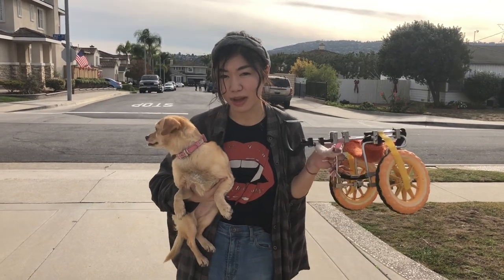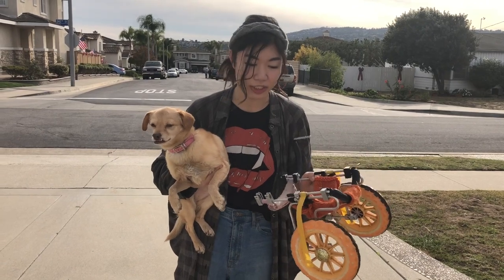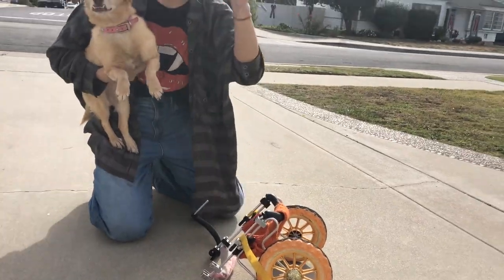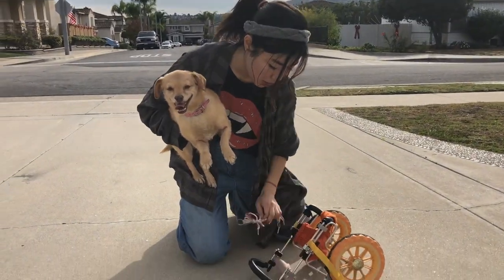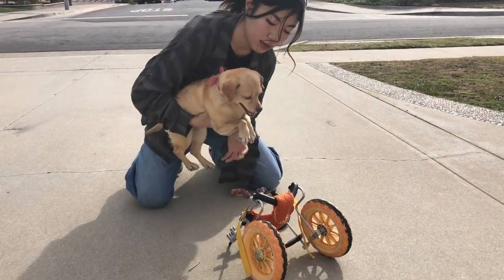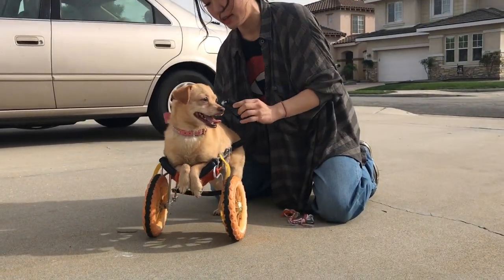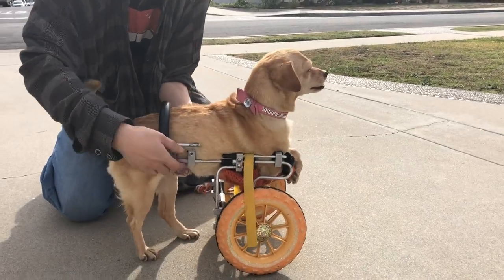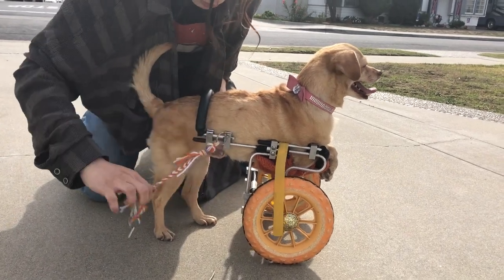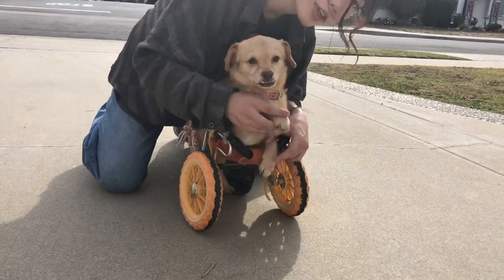Daisy has been using this wheelchair for about seven years now, so she actually cooperates with me when I put her in. I'm going to go ahead and demonstrate how to put her in the wheelchair first. I already took off the locks, and what I do is I go ahead and open up the supporter, then put her over like so, put the back, and then put this into the wheelchair and put the locks in.